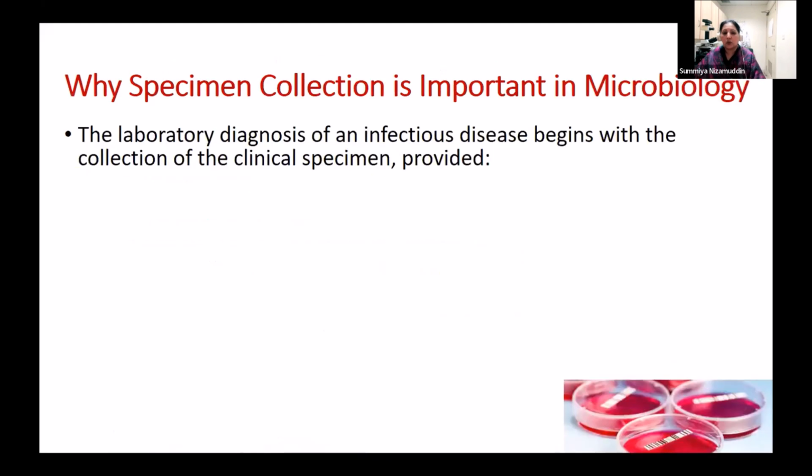Moving on. Why is specimen collection so important in microbiology? Laboratory diagnosis of infectious diseases actually begins at the time of collection of clinical specimens.